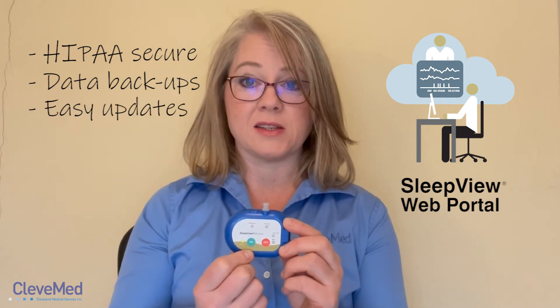The SleepView comes with cloud-based software that you can access through cleavemedsleepview.com. This allows your staff to access patient data from any location. The cloud-based web portal is HIPAA secure. CleaveMed backs up the data regularly and offers software updates easily.